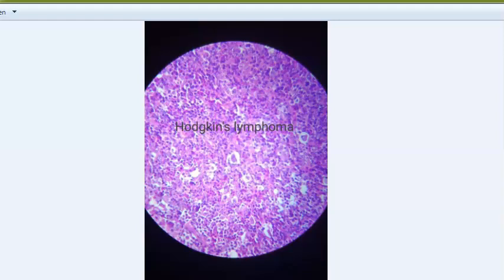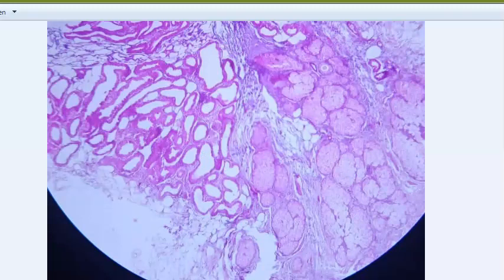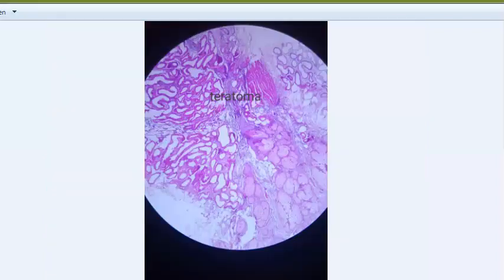You can see different types of cells here - this is a teratoma. You will see glands, stratified squamous lining - which is very typical - cartilage, smooth muscle, columnar lining, adipocytes, and sebaceous glands. Teratoma is a germ cell tumor that usually consists of all three germ layers: ectoderm, mesoderm, and endoderm. It can be mature (benign) or immature (malignant).